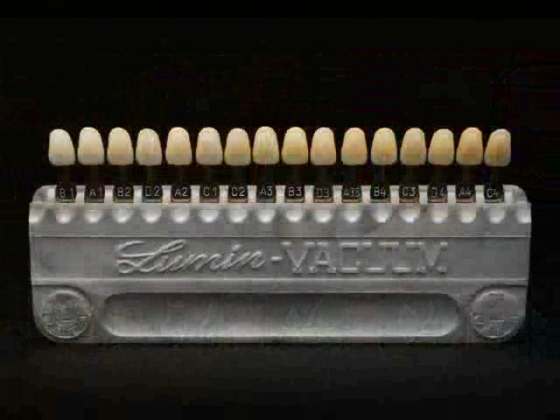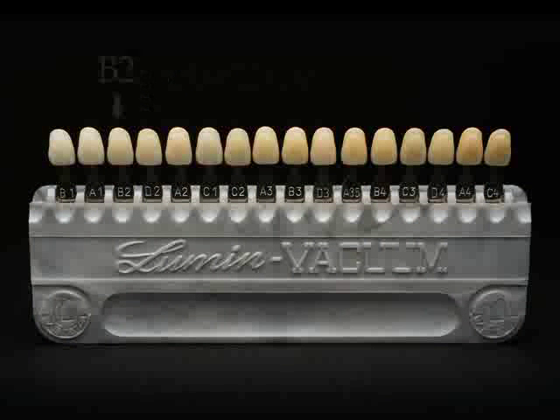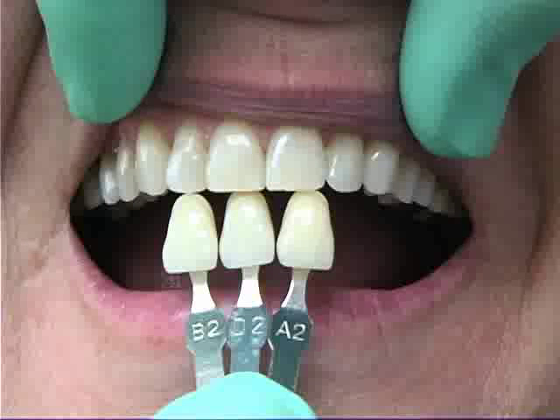Using the value-ordered shade guide, the preferred D2 sample is removed from the guide along with a specimen to its left and to its right. The B2 specimen to the left is lighter than D2, and the A2 sample on the right is darker than the D2 sample. The 3 value-ordered specimens are held in proximity to the natural teeth and a decision made as to which one best matches the teeth. The previous preferred choice of D2 is verified as the specimen most closely matching the natural teeth.